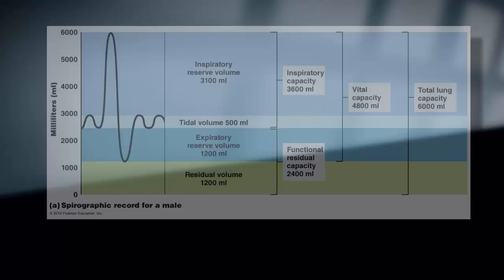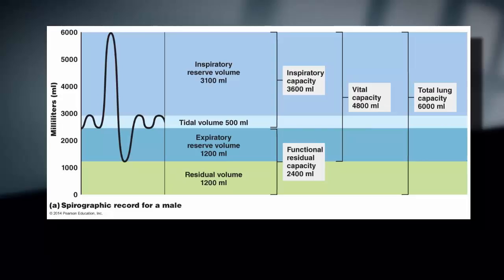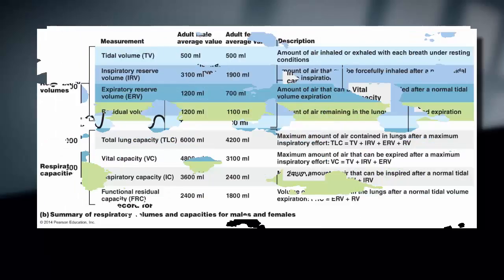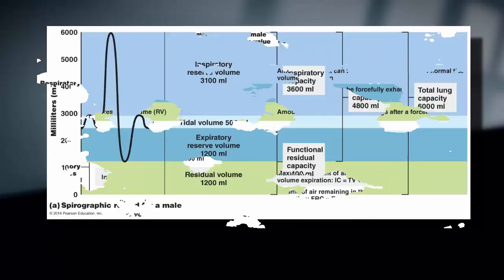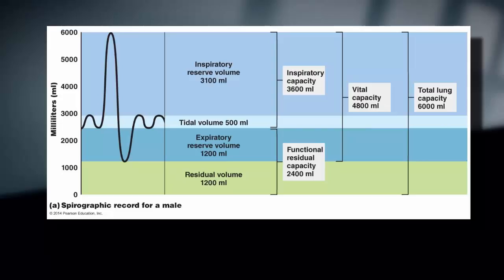If you haven't read up on this information yet, then you might be feeling a bit lost with all this new terminology. So what I will do now is give you a quick tour of the spirogram that shows many of the things that I've just mentioned. This picture is from your textbook, and along with its accompanying table can help you to understand all of the data that you will be collecting and calculating from your experiment.